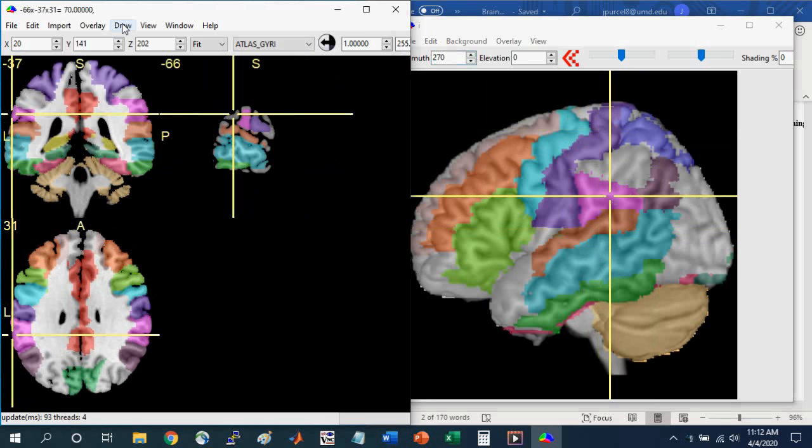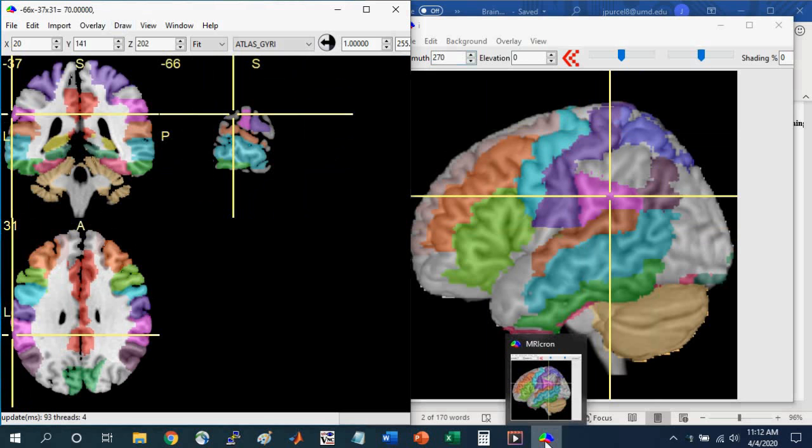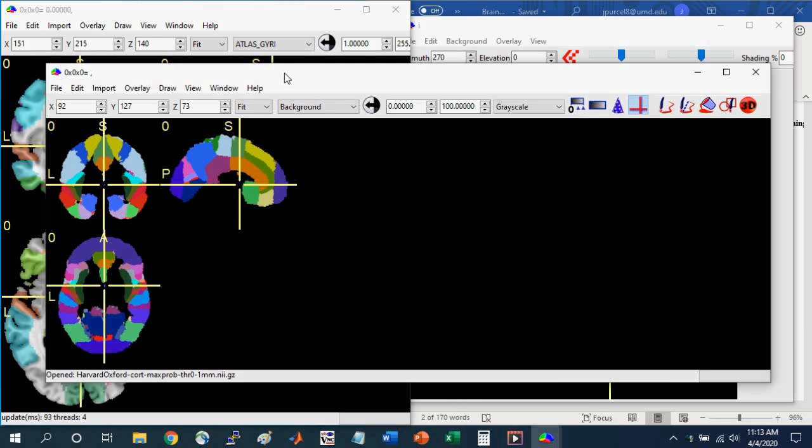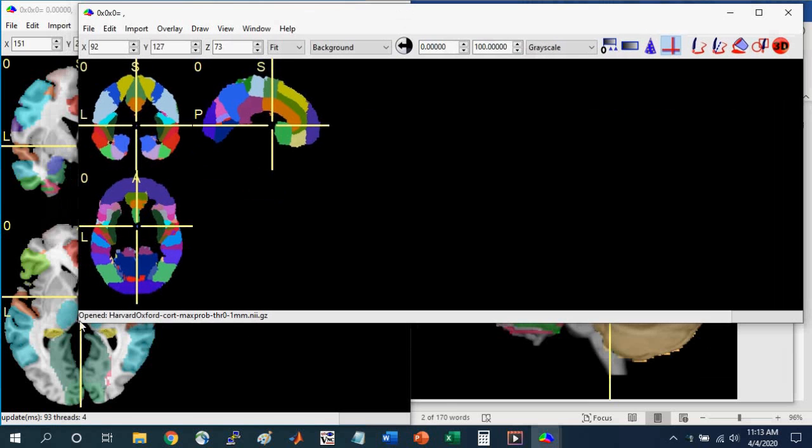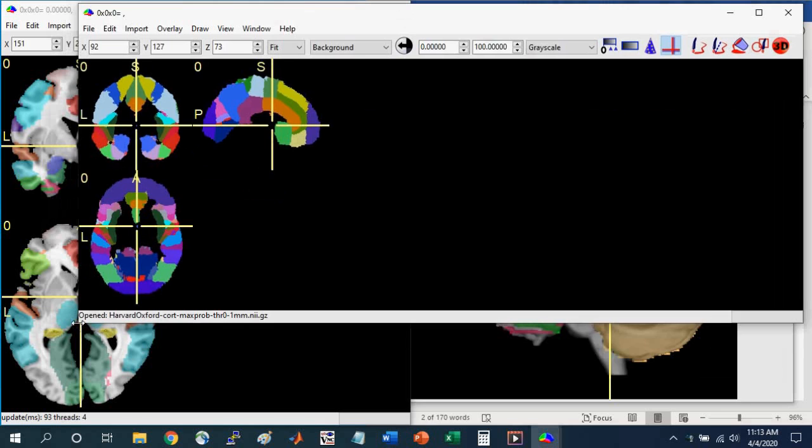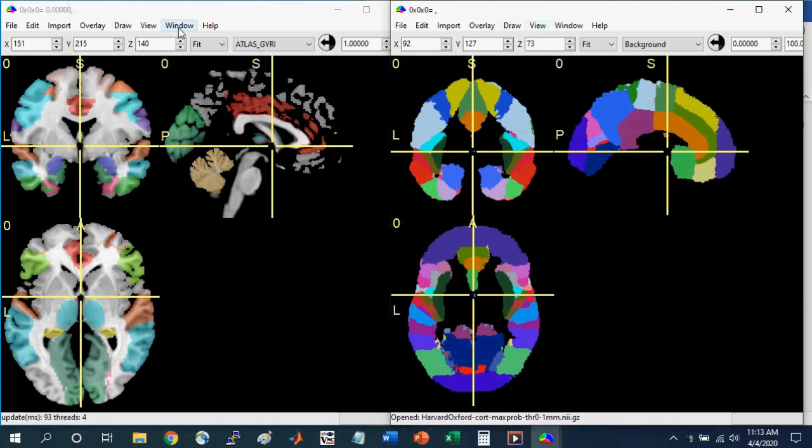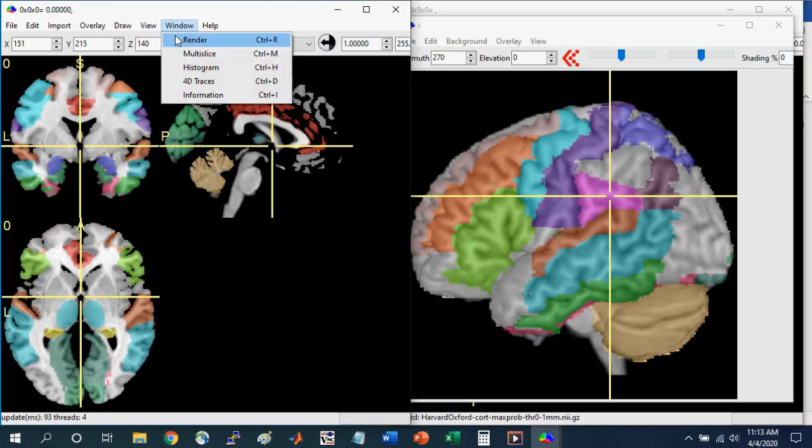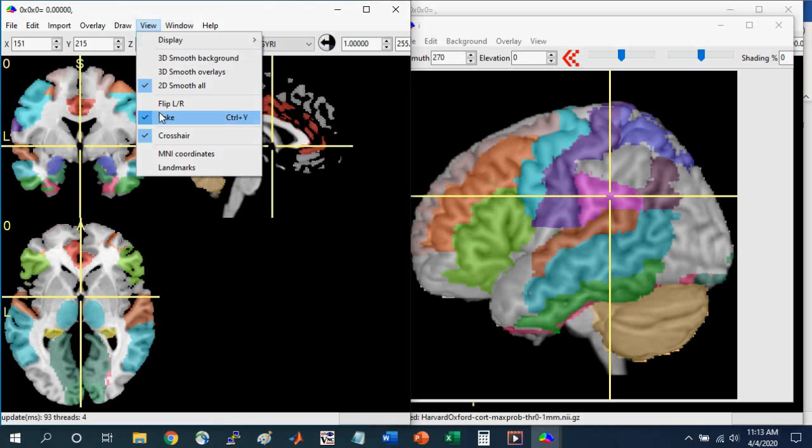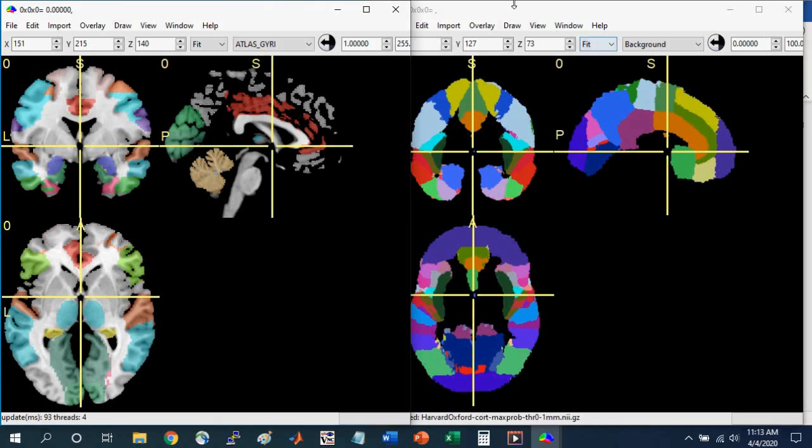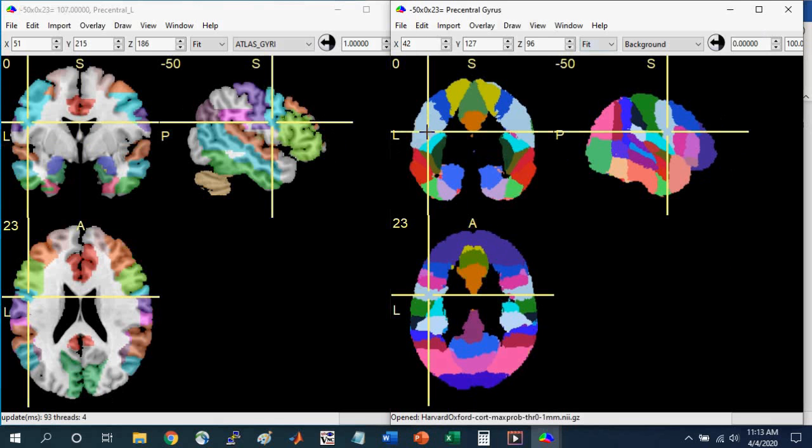So next I want to show you a very useful feature of MRI-Cron. So if I go down to the MRI-Cron icon and I right-click, I can open a new MRI-Cron window. And I can also yoke these two windows together. So I can go to View, Yoke, and make sure that this is checked in both windows. And so if I left-click in one window, it'll jump to that specific coordinate in the other one. And you can open as many MRI-Cron windows as you want. You're limited only by your computer. So this is a very useful way to navigate the brain and learn neuroanatomy.